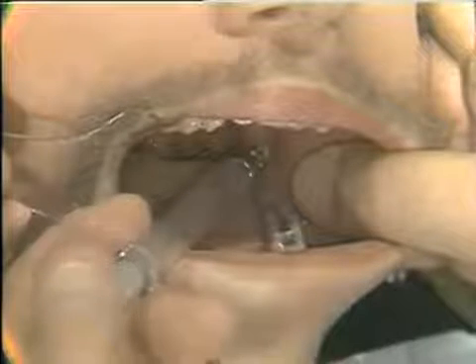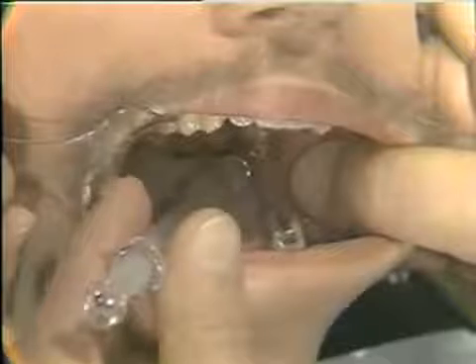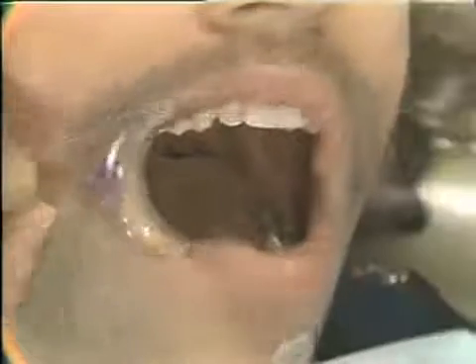For our purposes today, we'll just inject about a cc of solution. However, normally you'd want to inject approximately 2 cc's of solution, and then out quickly and allow your patient to close.